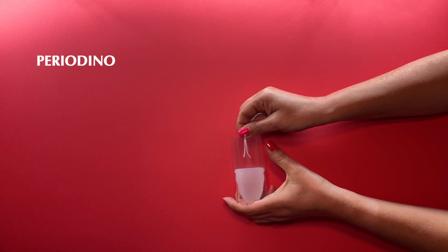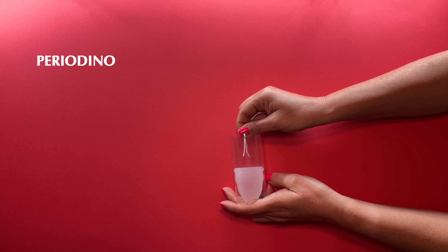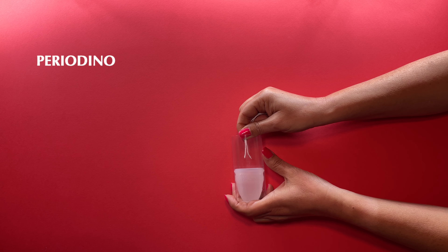As you can see, the distance from the rim of the cup to the threads is quite large when you have a high cervix, so the use of the menstrual cup and the IUD is compatible. If you have a medium cervix, you won't have any problems either.